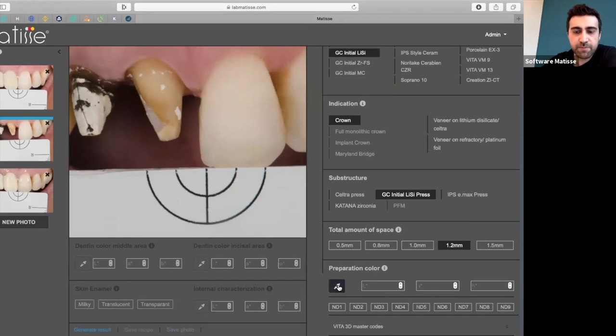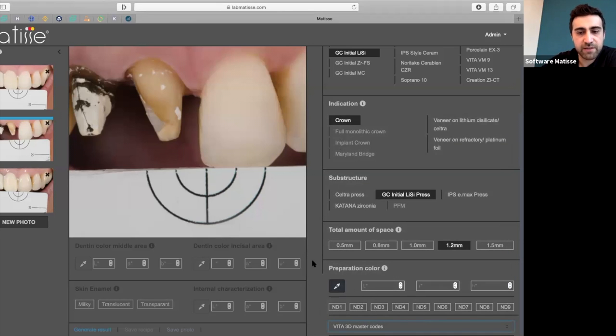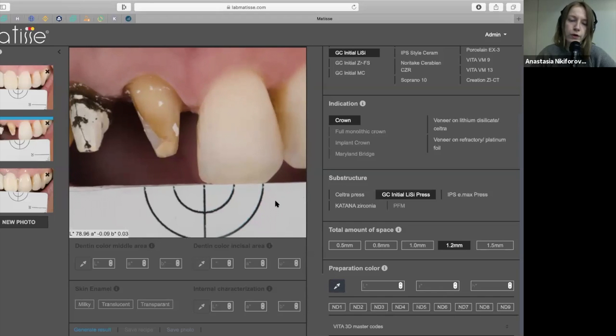So I can measure the preparation color, but if you are not able to get this image from the dentist, at least they have to try to give you the color of the preparation using a natural die material or the Vita 3D Master shade guide. If you are able to get the images of the prep, that is the best way to go.